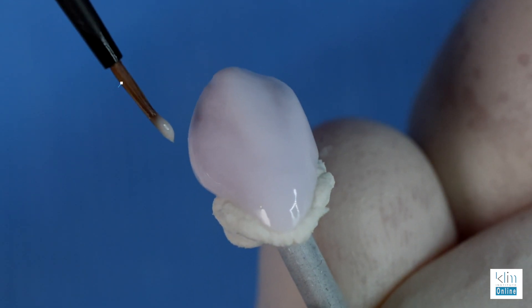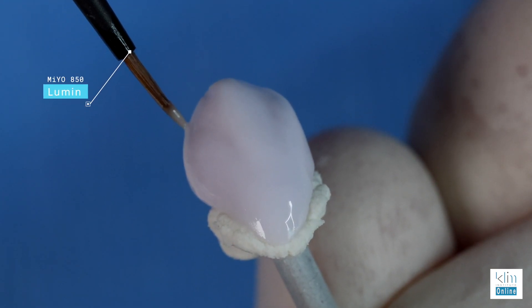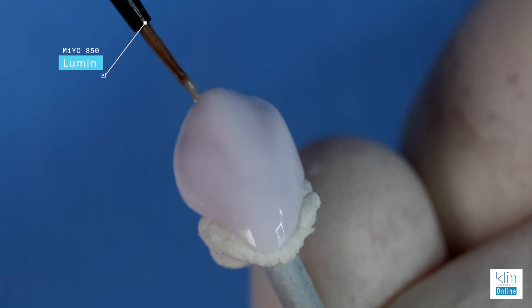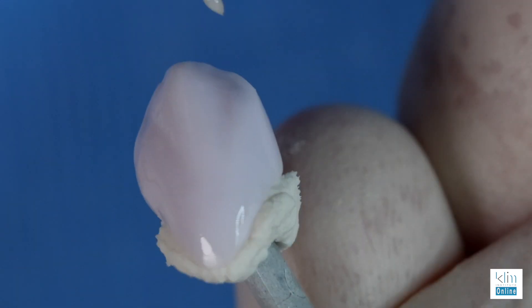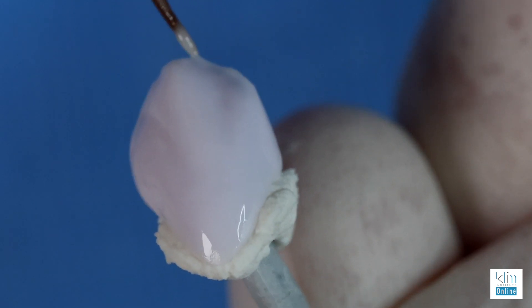The halo zone on the incisal edge can be highlighted with Lumen. This is a high-value application. Keep it a bead line on the edge. Notice on a canine, in that midsection on the incisal edge, the enamel is thicker. So we don't see the translucency in that zone, so we can highlight it with a little more Lumen.